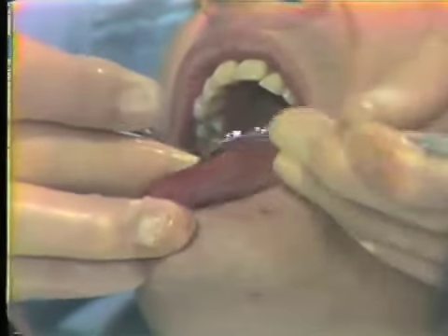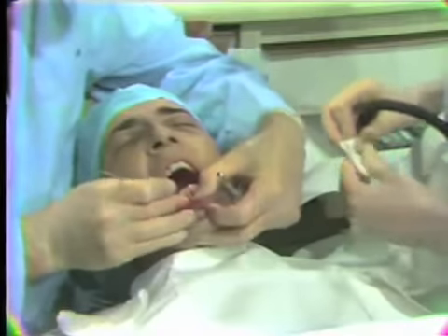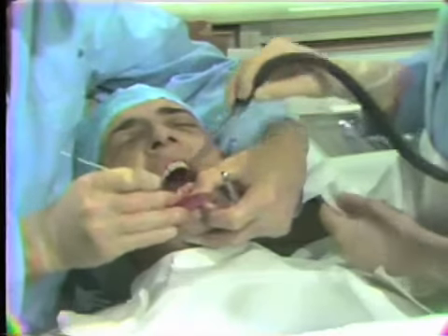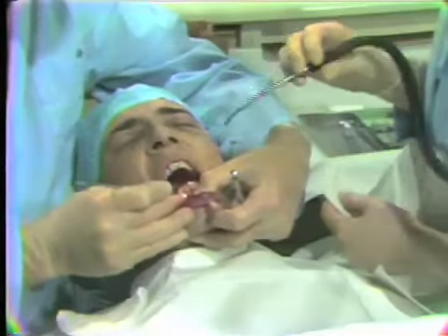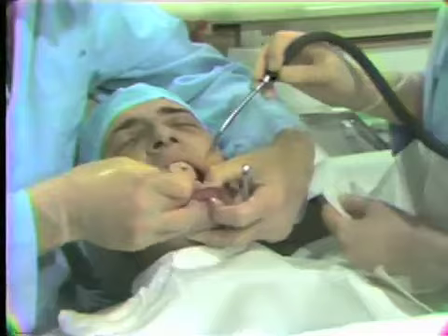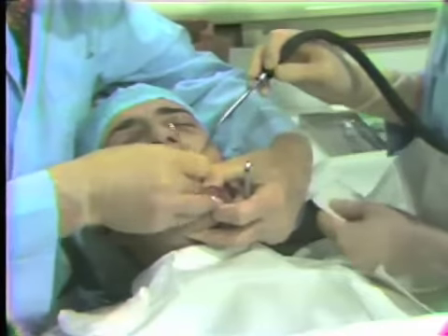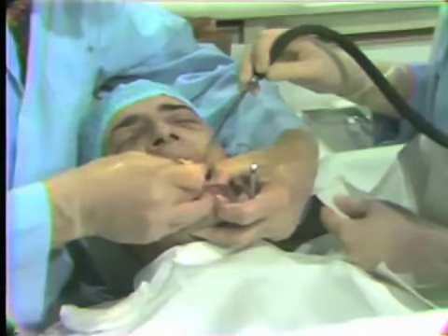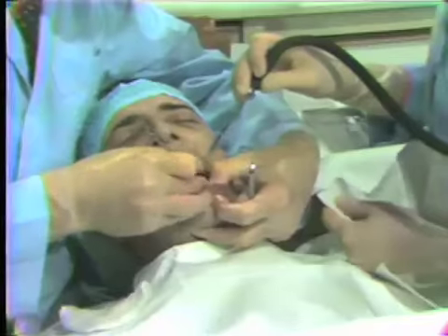You note that as we displace the diseased tissue from the interproximal areas, the assistant is standing by with the aspirator so that she can cleanly remove the tags and remove the bits of tissue and debris from the aspirator tip, which keeps the tip area clean and free from the accumulation of calculus, from the accumulation of the tags and bits of tissue, so that we can see more clearly in the area to carry out our debridement procedures.